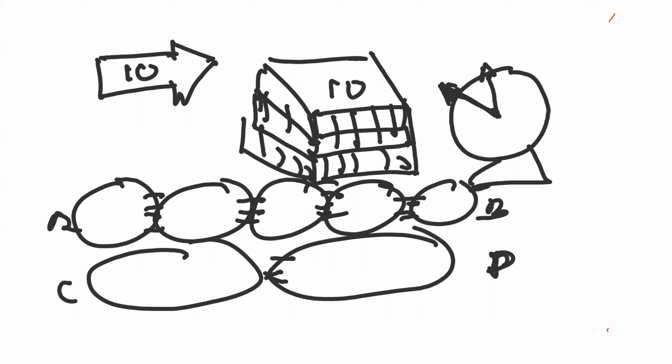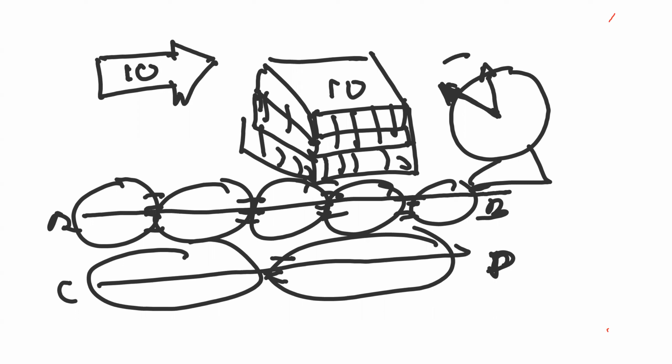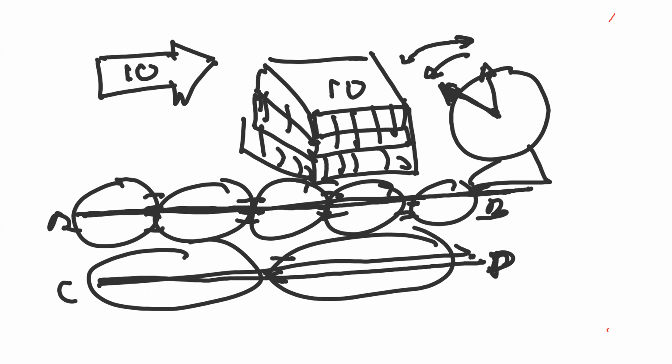So if there is a quick depolarization, that means quick needle fluctuation. If the depolarization is very slow, the needle fluctuation will be very slow and calm. If there is a high depolarization rate, the needle fluctuation rapidly happens and rapidly returns.